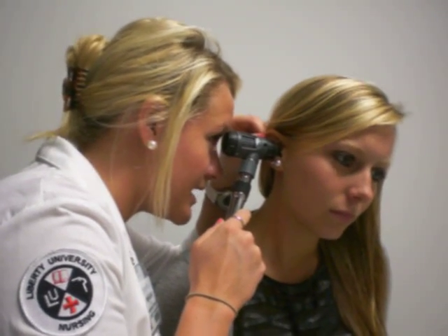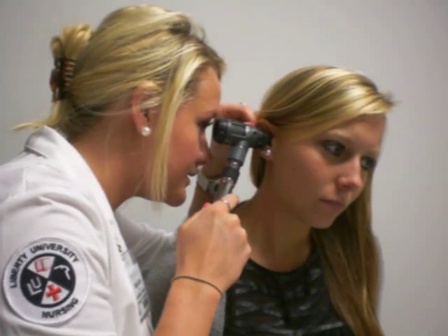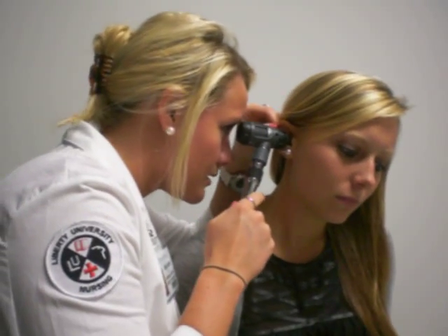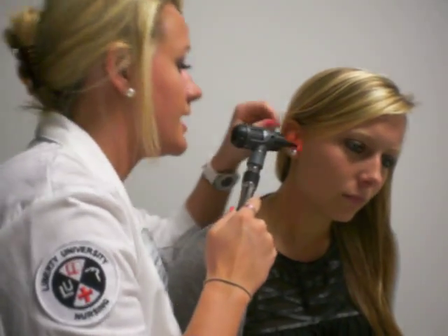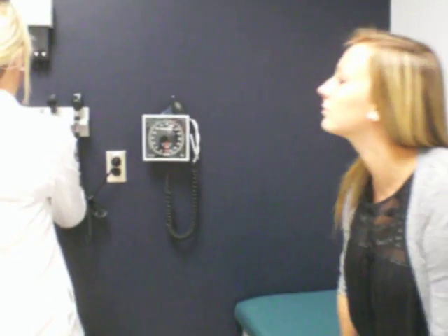Alright. I am unable to see the cone of light, but if I could, it would be towards the bottom of my visual view here. Alright, looks really good. And then normally I would look into your other ear as well. There you go. I'm going to throw this away.